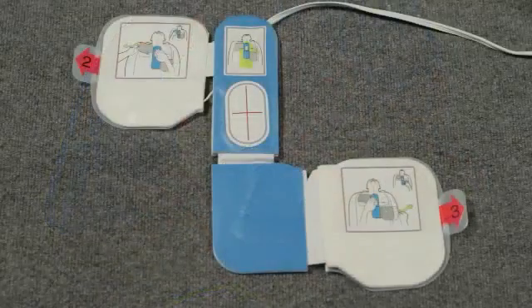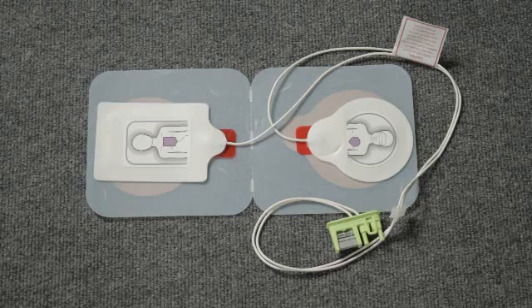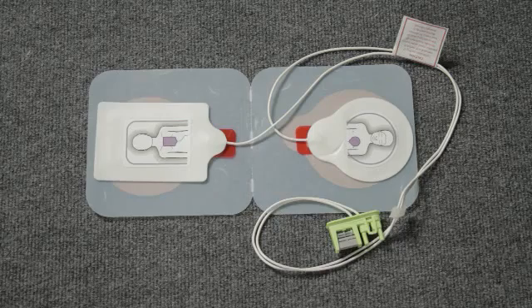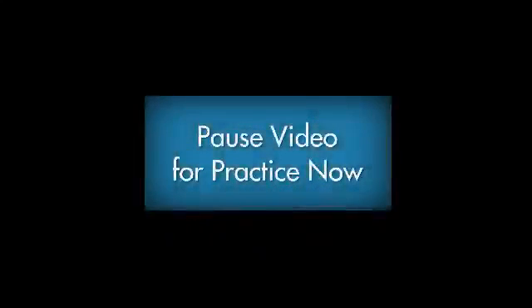One last note. Always use adult AED pads for adults. For children less than 8 years old or weighing less than 55 pounds, use pediatric pads. If they are not available, use the adult pads. Never use pediatric pads on an adult. Now practice using the AEDs in your classroom with your instructor.